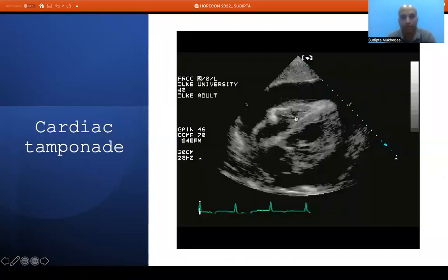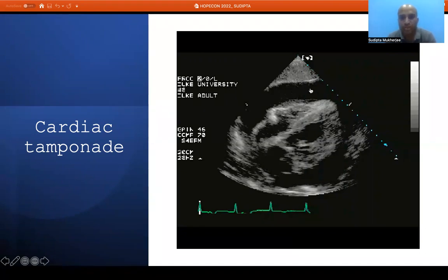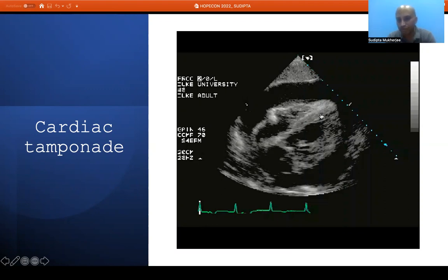With the subcostal view we can also rule out cardiac tamponade. If there is a significant amount of fluid in the pericardium, what matters is not the volume of fluid but the associated hemodynamic change. Even a small fluid can cause hemodynamic instability, and we can find diastolic collapse of the right ventricle and systolic collapse of the right atrium — the diagnostic findings of cardiac tamponade.